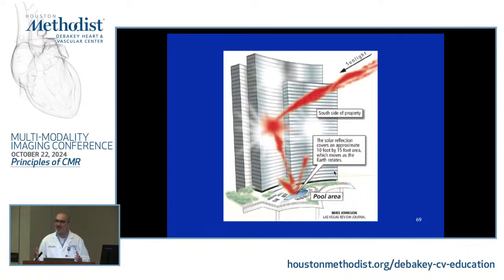And that's why we no longer use the term safe or unsafe, we rather say conditional, which is that in certain sets of conditions, it's thought to be an acceptable risk. But just as this showed you, they had to figure out a way to readjust this or close the pool for these 2 days of the year. You have to recognize that there are any number of possible permutations, depending upon the patient size, whether they have 2 devices, where exactly the device is. There are so many possible things that you cannot possibly think of.